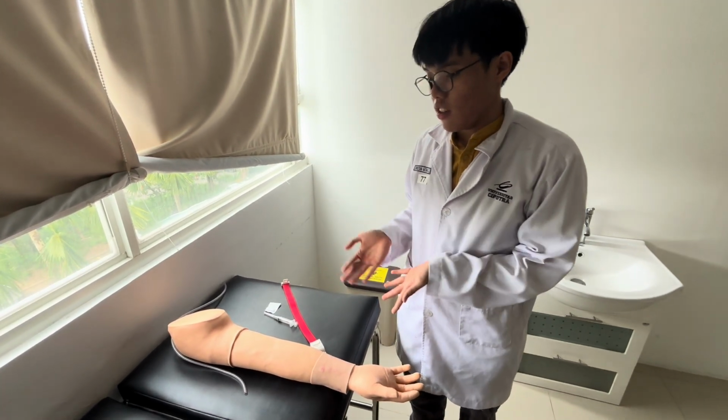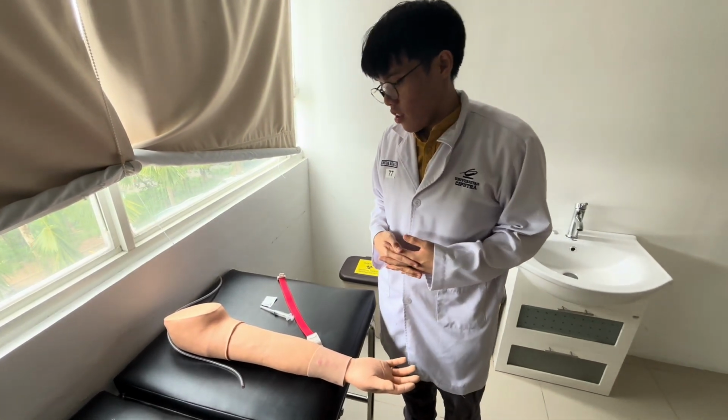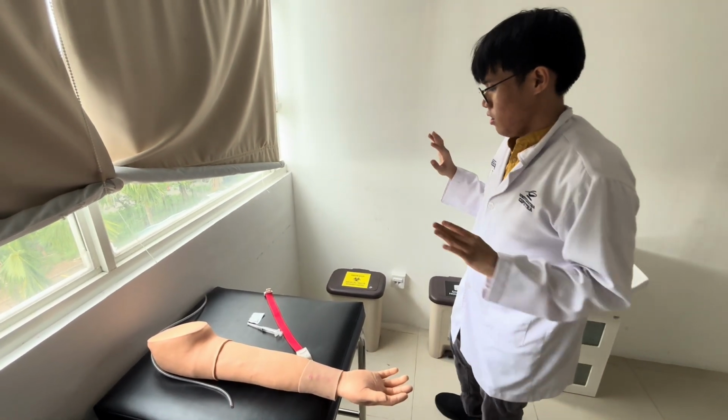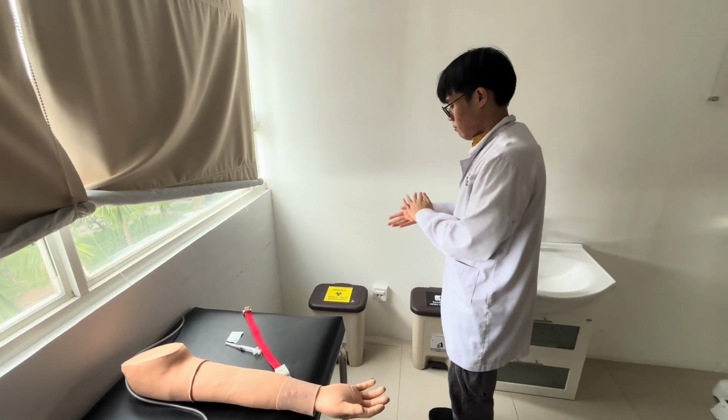Before we start, may I have your consent? Okay, thank you, sir. So first we will conduct the intravenous one. So first I will do the six step of WHO approved hand washing.